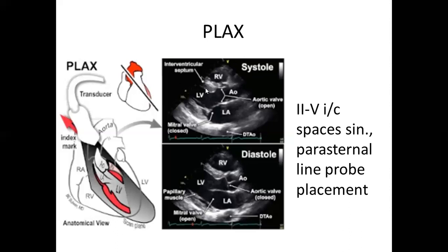And primarily when we speak about whether it is a systole or diastole, that is about left ventricle in most of the cases. So if you see some notification systole, and you see this is right atrium or something, you should think, okay, maybe it's a systole of the left ventricle.